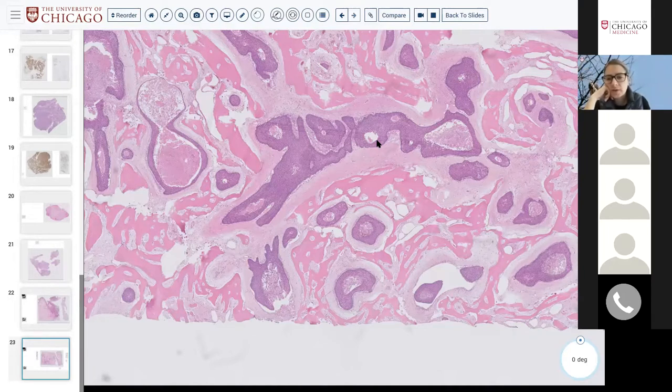So you can have carcinomas in your sinonasal cavity that are non-keratinizing squamous cell carcinomas that are related to high risk HPV, but the sinonasal papillomas, if they're HPV, they're low risk. And sometimes they even have koilocyte-like atypia. If you have a high risk HPV in your nose, it's not going to create a sinonasal papilloma really. It's potentially just going to create invasive carcinoma.